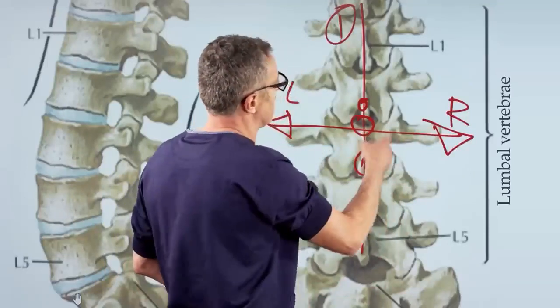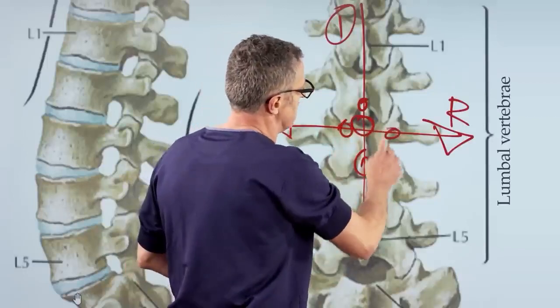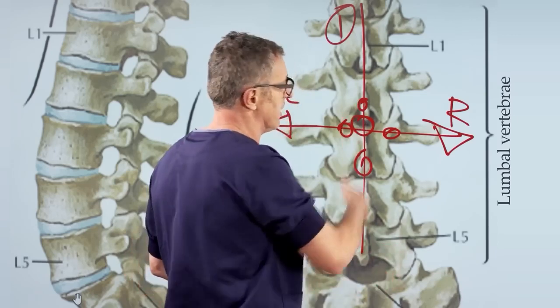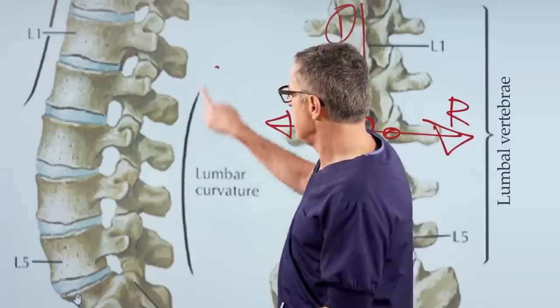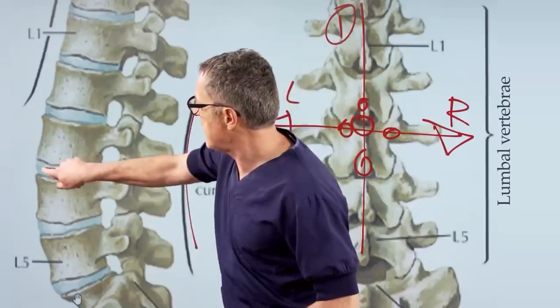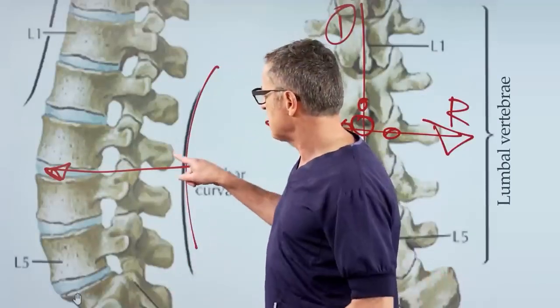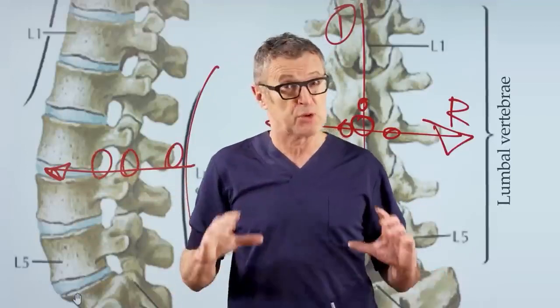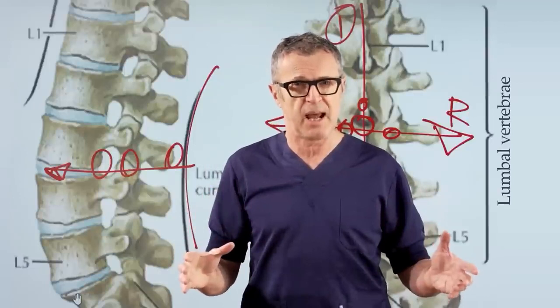This will impact your micro redirections or reinsertion of the needle along the horizontal axis to place it in the midline. A third dimension that is just as important is the depth. Always ask yourself at which depth my needle is contacting the spine, because that will determine very much what you do when you redirect the needle for the next attempt.